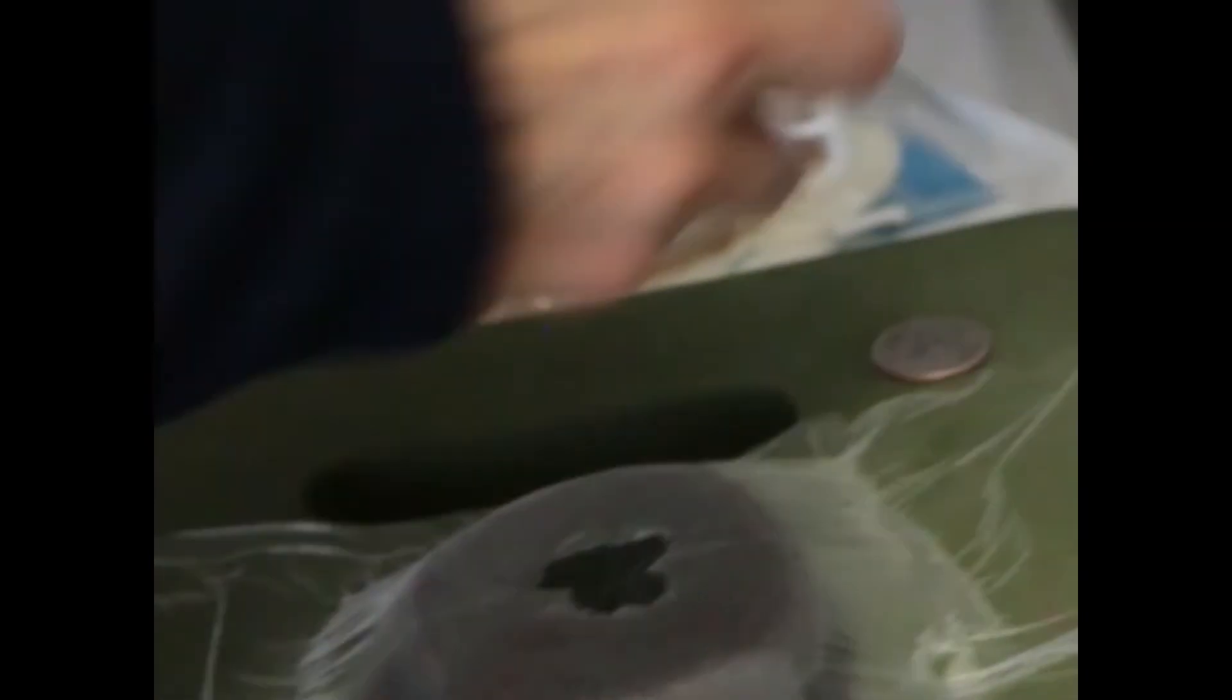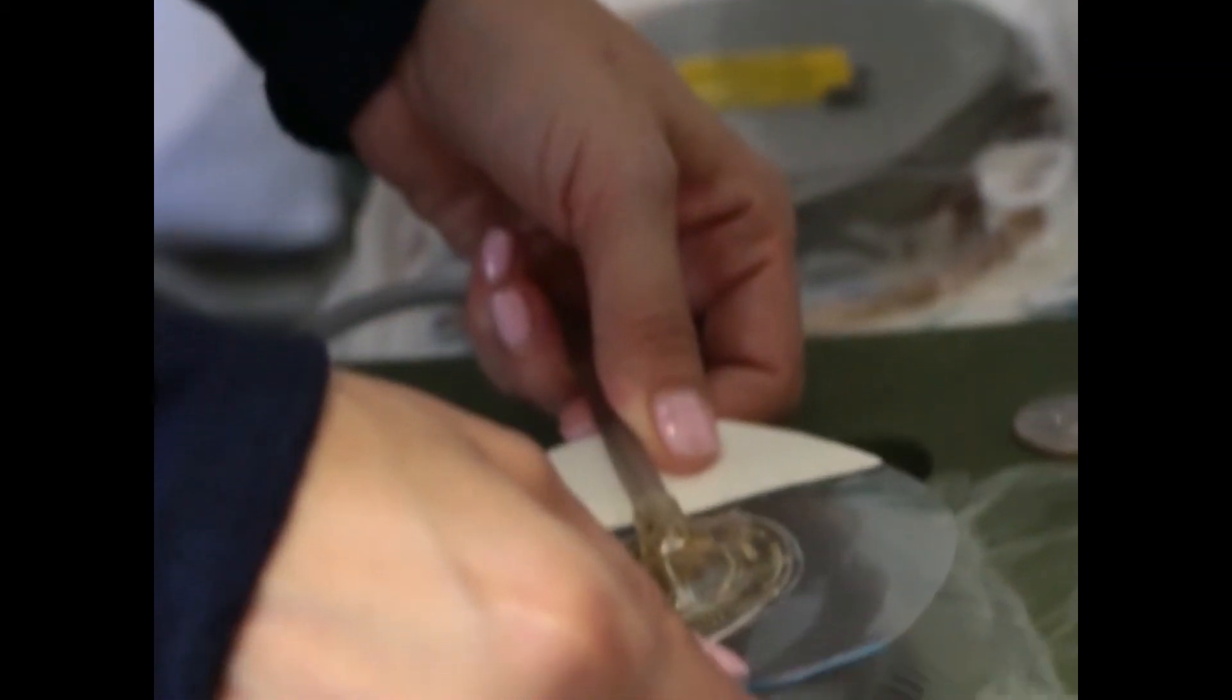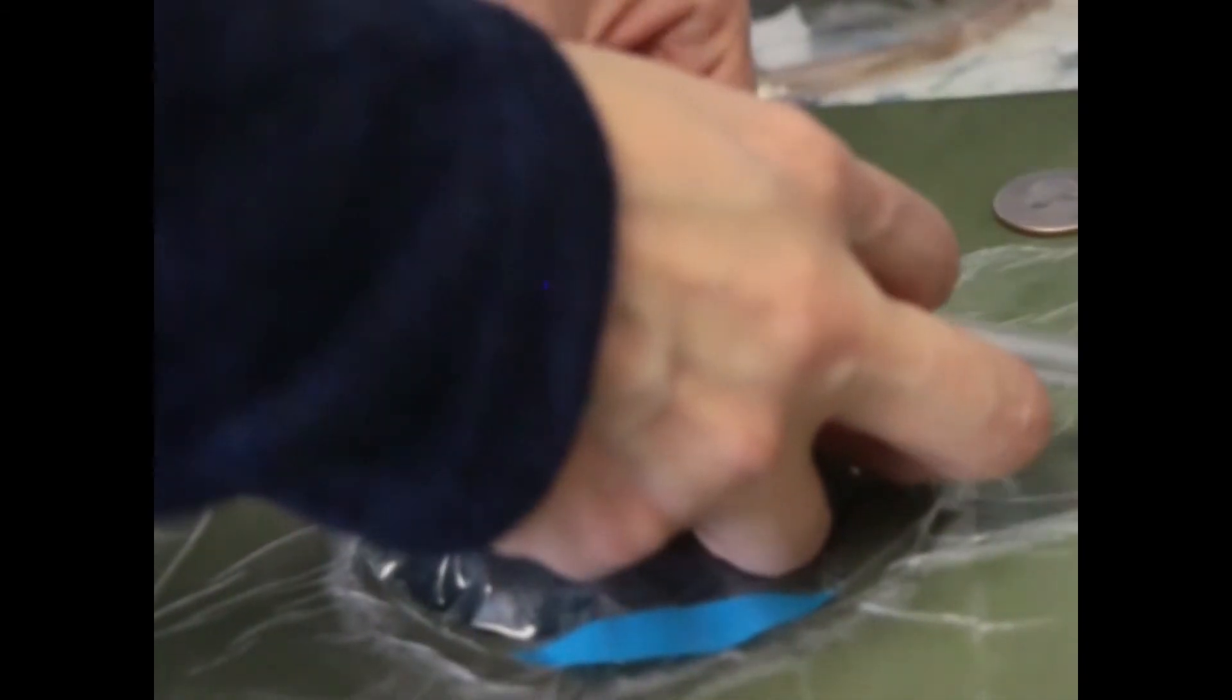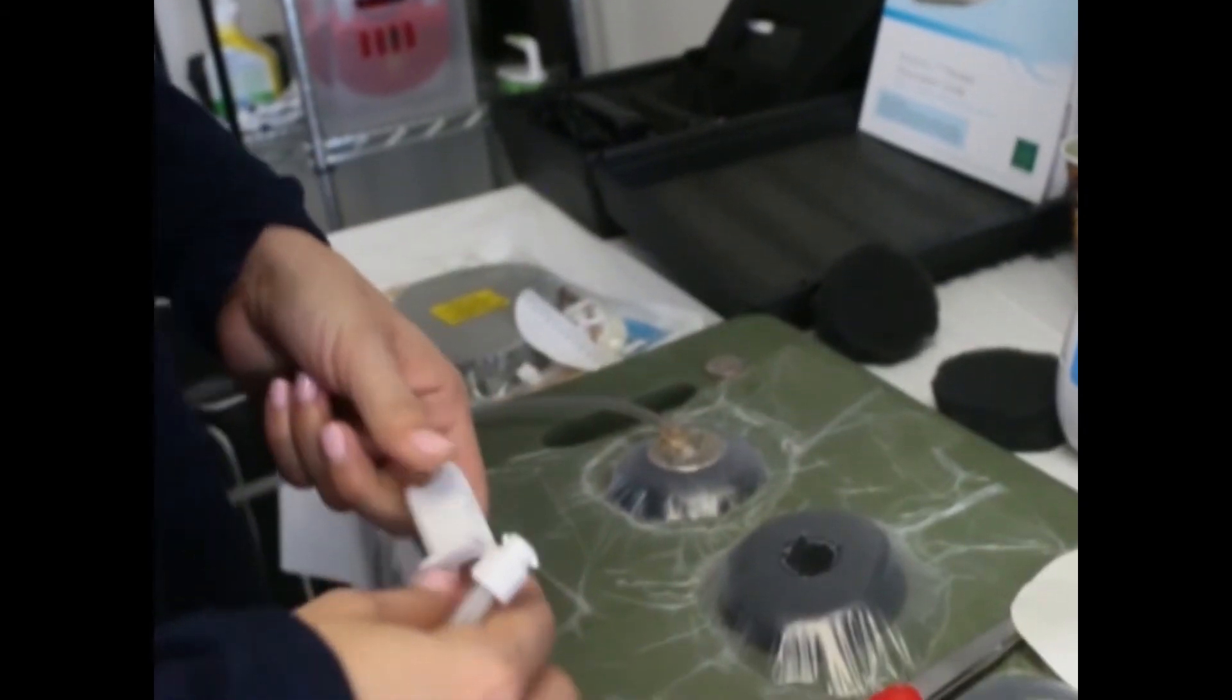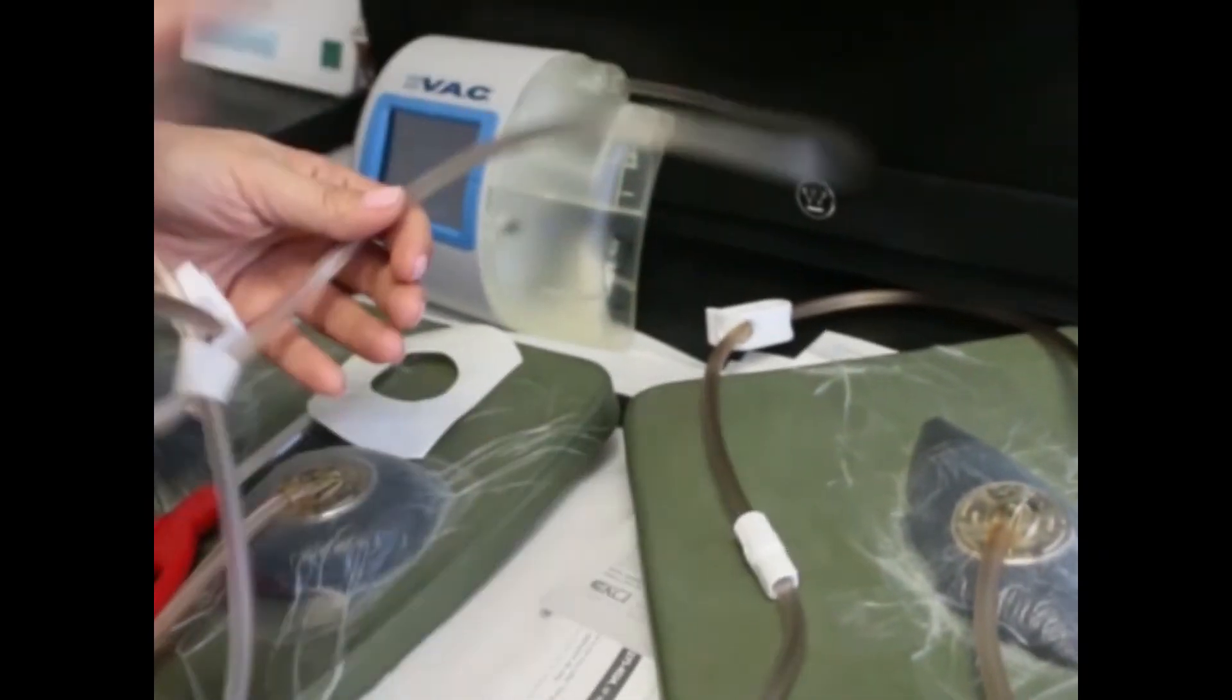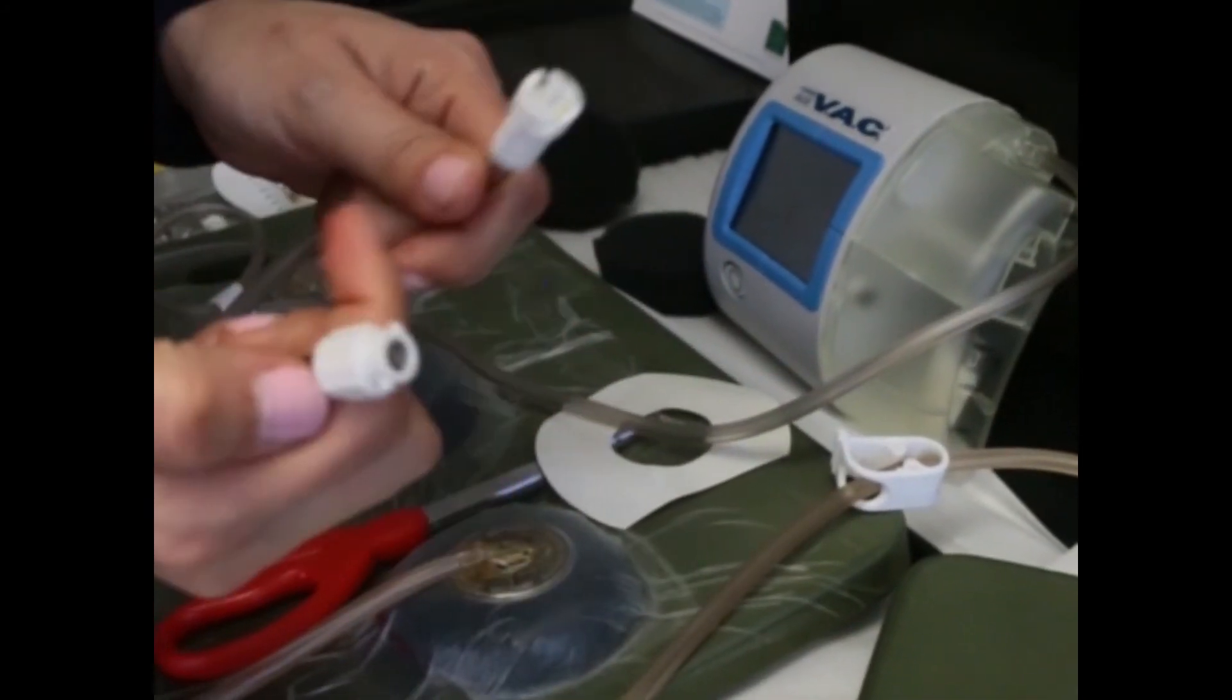So once that's done, you can kind of measure it. Perfect. So you're going to take off number one, place it right on top. Right there. Wonderful. I'm just going to flatten it out. Flatten it out. And then you're going to go ahead and remove number two, which is this one right here. And if you want to clamp it here, you're going to connect it to your vacuum, which is this one right here. Yeah. So now it goes.